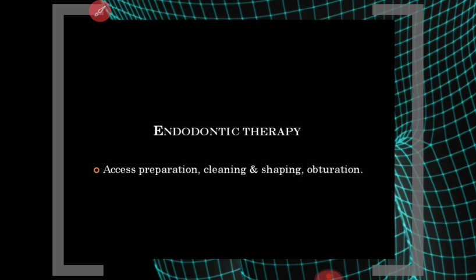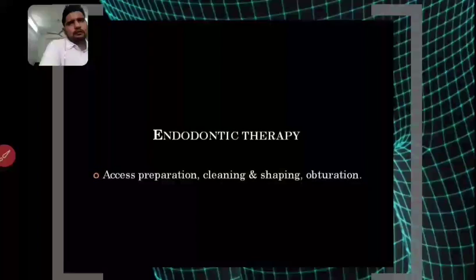So now from this point onwards, I'll be talking about the main therapy part, how to do it, what to do. Once you have diagnosed your case, once you know which tooth it is, once you know it is irreversible pulpitis, or chronic periapical abscess, or chronic periapical periodontitis, whatever your diagnosis is, you will go to therapy. So we'll start talking about it.